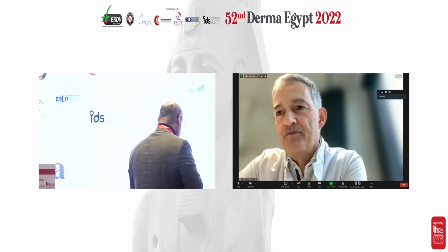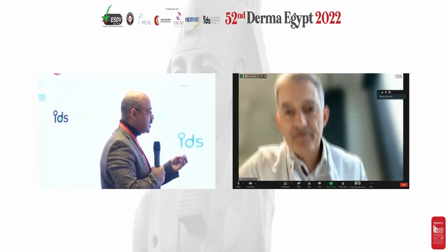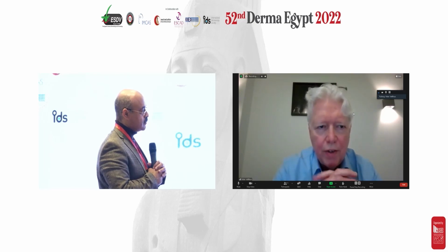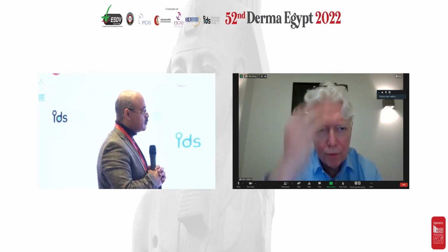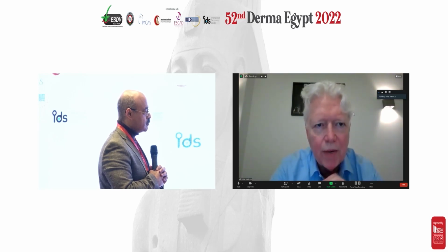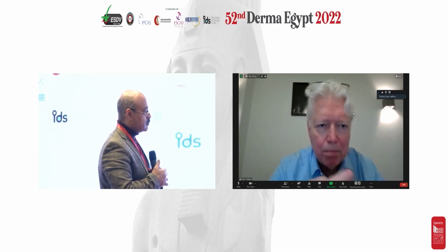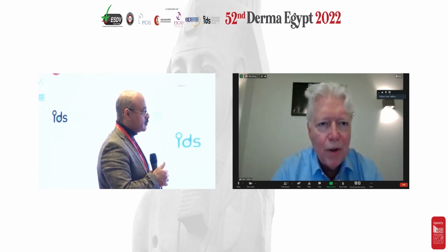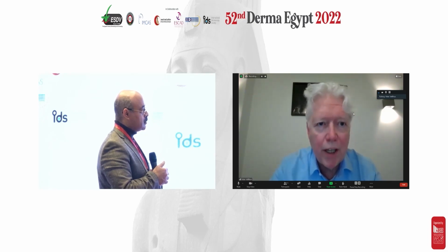Okay, thank you. Peter, you are the master of using combination treatment for scars. So when do you combine the laser with injectables, whether fillers or toxins or whatever? When scars are still in the process of remodeling, in areas where it's feasible, I always use toxin. So on the forehead or on the chin or on other body areas, I would go for botulinum toxin. And at the same time, I would use a laser, either a pulsed dye laser or a fractional CO2 or erbium laser. I don't think the Q-switch lasers will do much on the healing process, only on the hyperpigmentation. So that would be my protocol, in conjunction with sometimes vitamin C, vitamin E creams, etc.